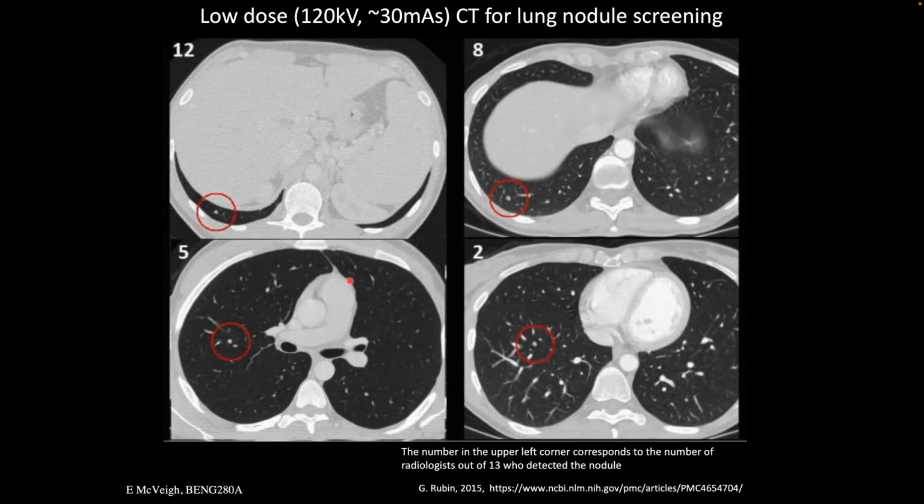What we're seeing is that a clinician will have sitting beside them, it won't be a resident who's read as many as they can, or a fellow. It'll be this machine that just says, hey, you should take a look at this thing, because I got a 50-50 shot this is abnormal. And then you can get in there and take a look at it. So this is one of the areas where I think broad spectrum deep learning is a big deal.